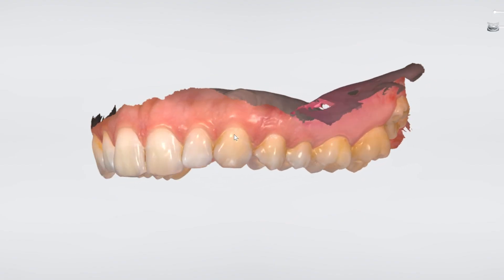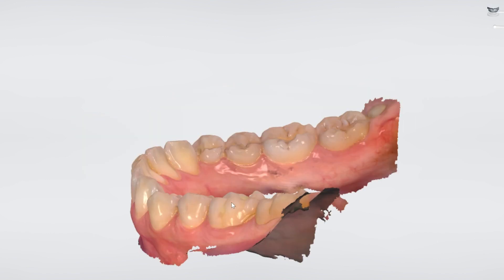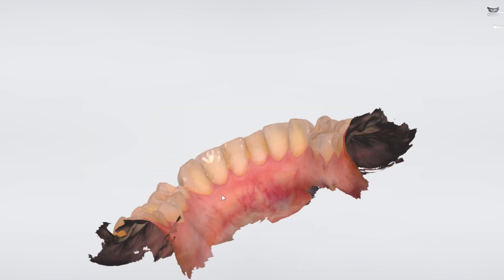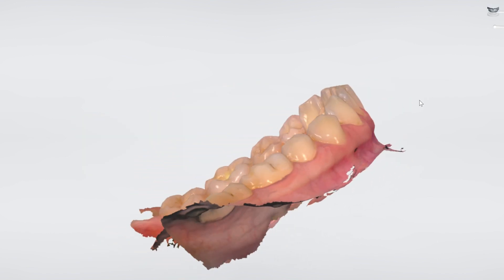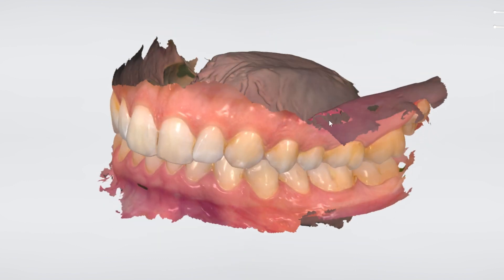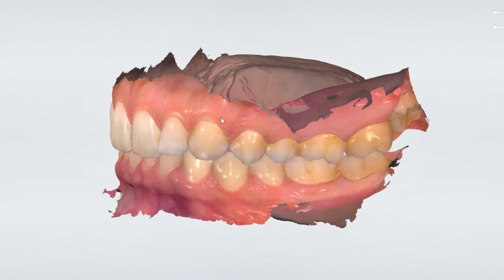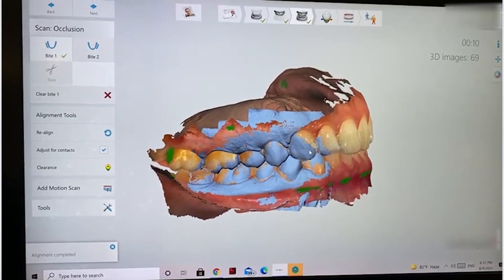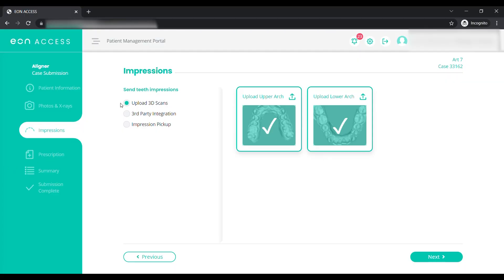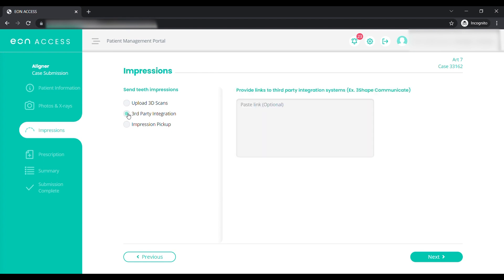Inspect the scan after it has been processed. Check for solid incisal edges, interproximal anatomy, terminal molars, enough gingival margins, and the correct bite. When you are satisfied with your digital scan, it can be exported as an STL file to be sent directly to EON through the EON access portal. Alternatively, a third-party option is available for certain scanners to send files directly from your scanner.